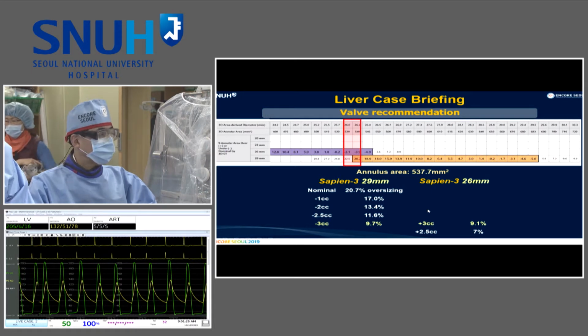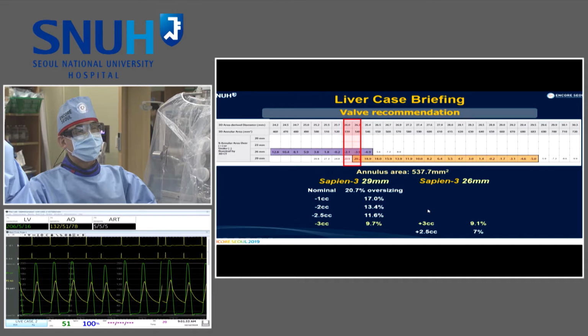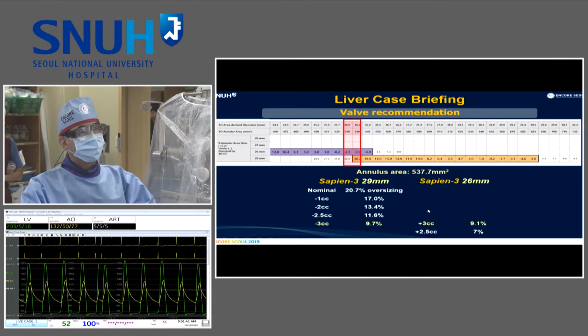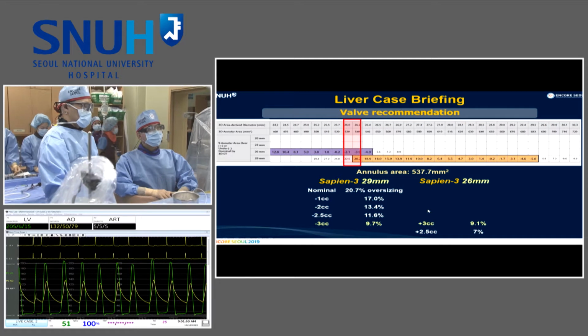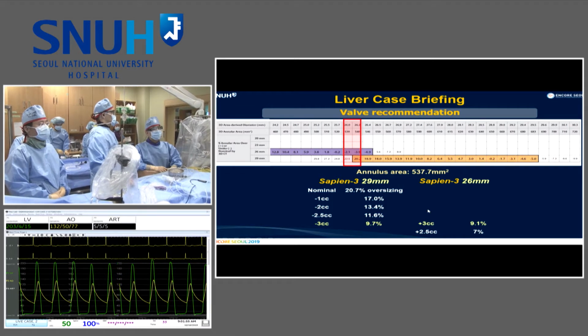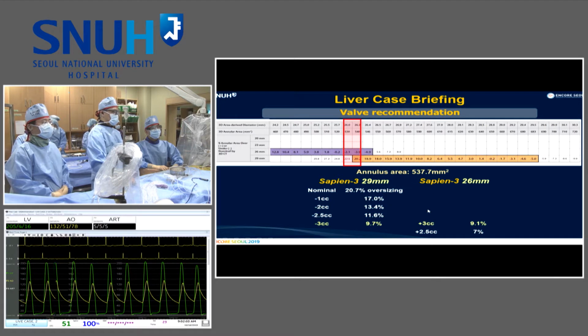My concern is just a lot of calcifications, and that's why I would be very careful not to oversize and not to be too aggressive in a balloon expandable valve situation. If Lotus was available, I don't know whether it's available in Korea yet, this would be a good case for Lotus actually. But since this is not an option, now we're dealing with the Sapien or the Evolut. Probably I would not take a 34, I would probably take a 29 Pro if I take the core valve, but I'm assuming you're taking the Sapien, right?